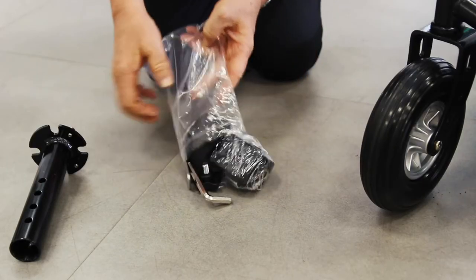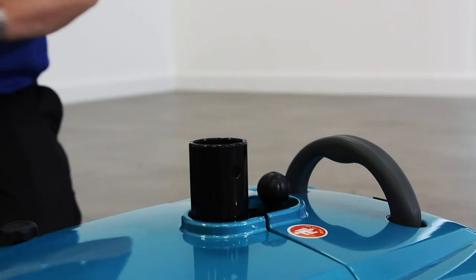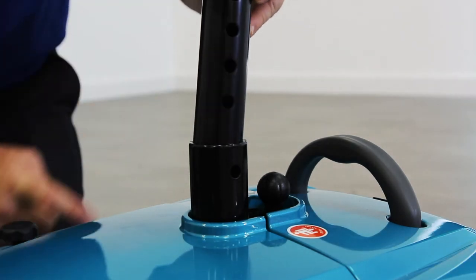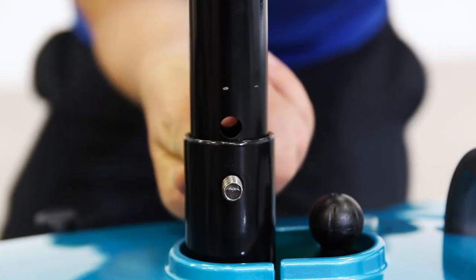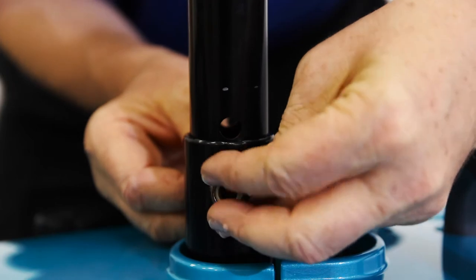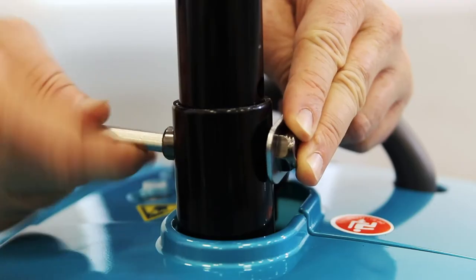Now it's time to install the seat. For this you will need the seat post, a bolt, washer and nut, and an allen key. Drop the seat post onto the back of the chair. You can use the holes on the side of the post to find your desired seat height. Once you have found a comfortable height, push in the pin to secure the seat in place. Next, secure the bolt with the washer and nut and tighten using the allen key.